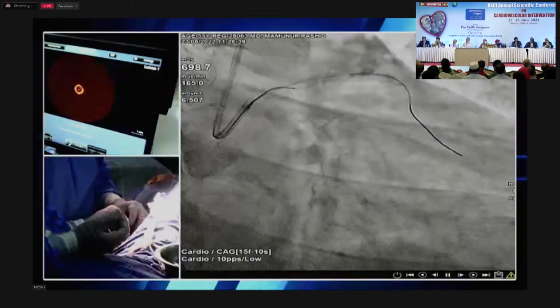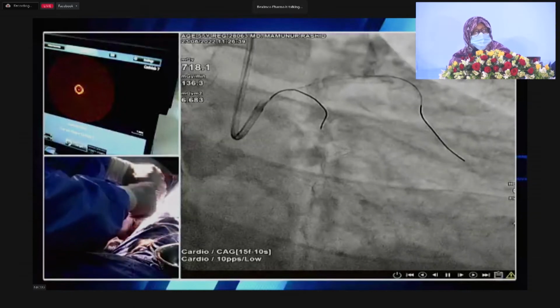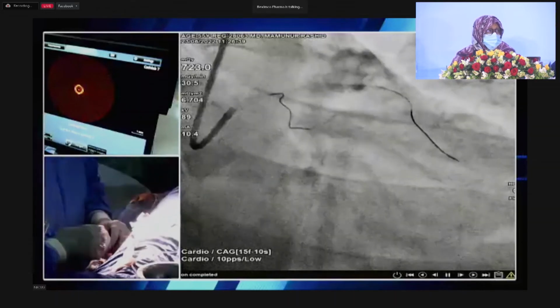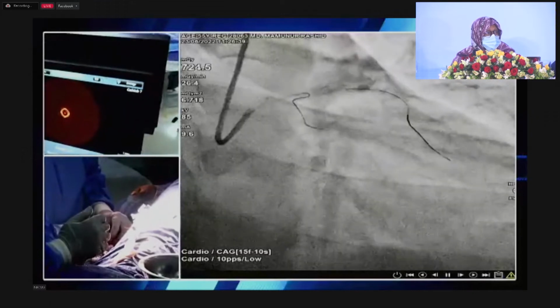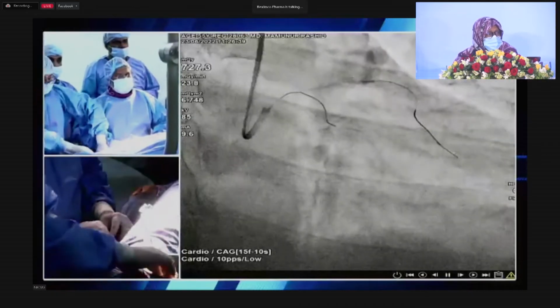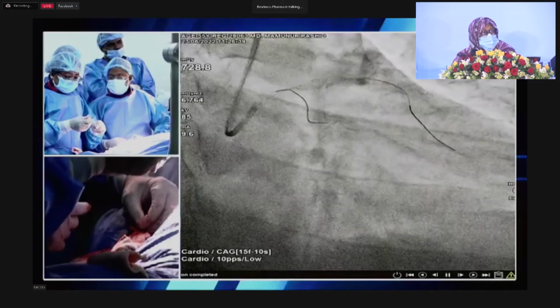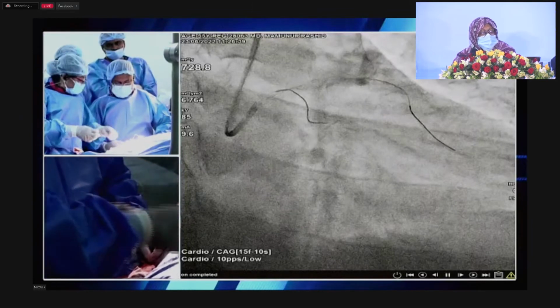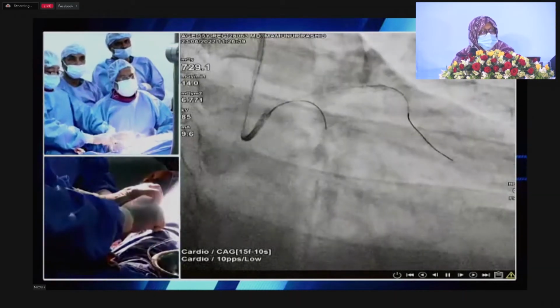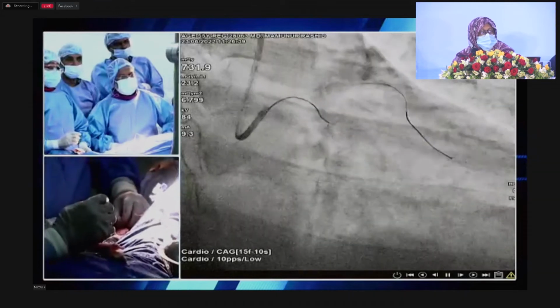I've been following this. Keeping the wire there is always better to keep your lifeline, because when you are using a big balloon and dilating, a strut might fracture, you never know. Or something else might happen, so you might have to deal with the circumflex again. If you can take it off when you use a 4 millimeter stent, you can always take it off when you're using 5. But for me, I keep it there. We want to do the job as near to perfection as possible and face fewer problems. So to be on the safe side, I think it is a good strategy to leave it there.